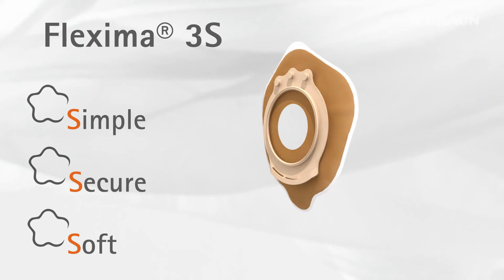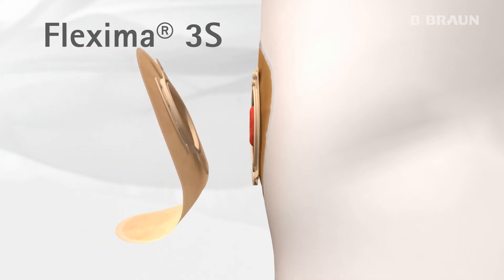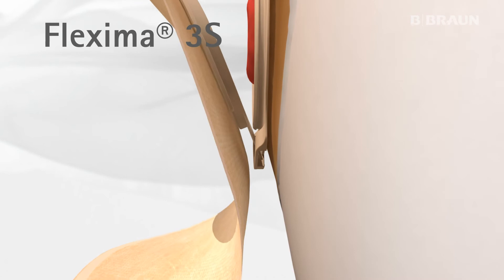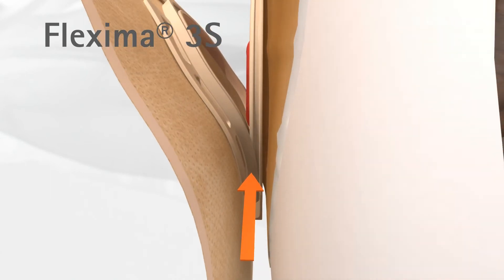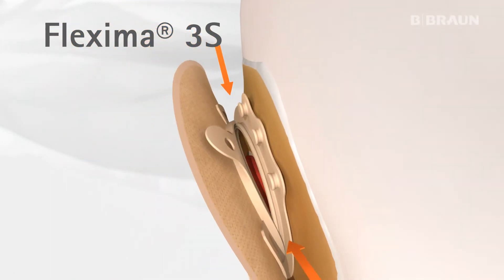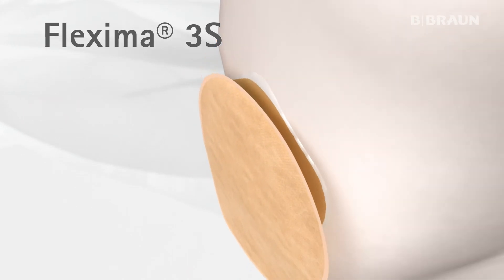Handling the Flexima 3S system is extremely simple and intuitive. First, the guiding tab inserts by itself into the bag slot. Second, engage the two rings together by pressing at the bottom of the coupling system. Third, slide up two fingers upon the rings to assemble the coupling rings. And the last step, finalise by locking the security button at the top.